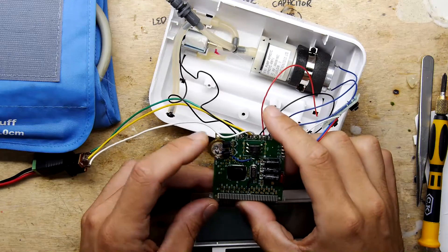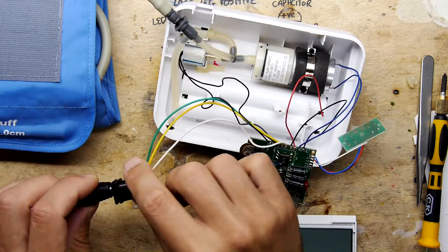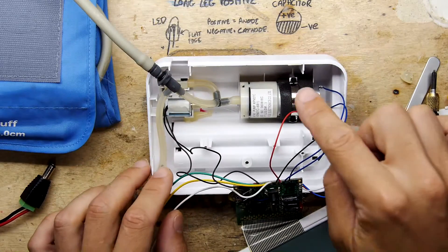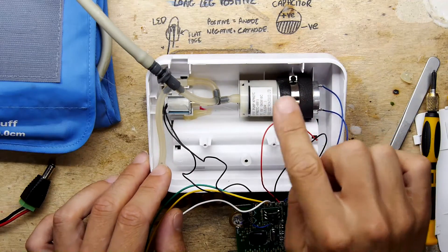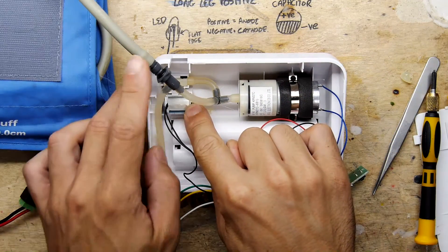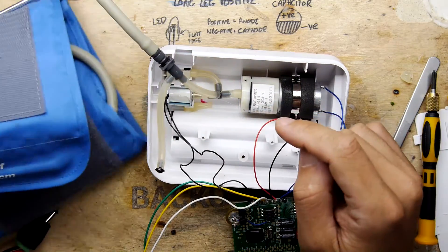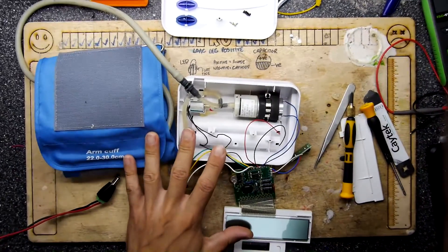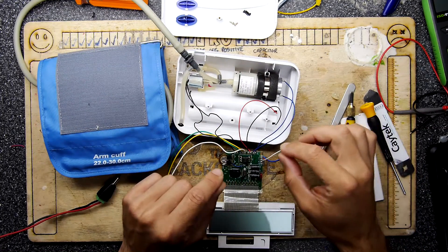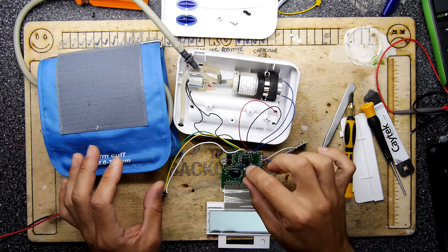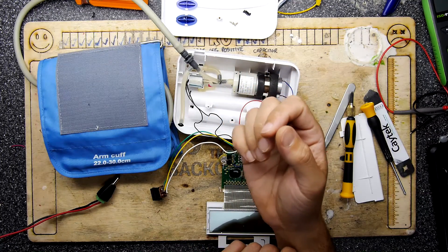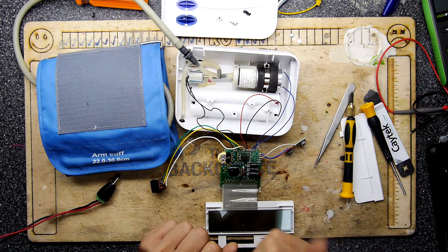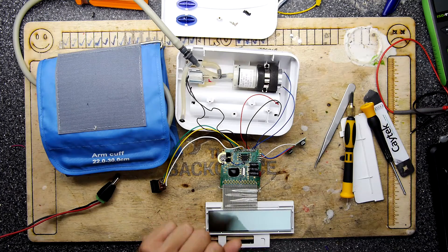You've got a piezo buzzer. You've got a couple of good transistors. You've got a nice DC jack. You've got a really good air pump and dump valve solenoid and intake filter. And then you've got your pressure cuff. So gosh, I suspect you should be able to actually wire these up and try to make your own, you know, at least pulse monitor, if not blood pressure monitor. And that is a very interesting idea for a future video.